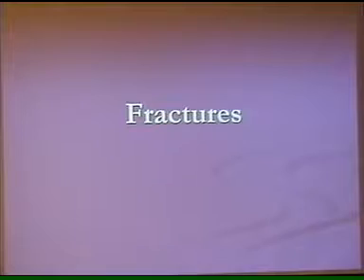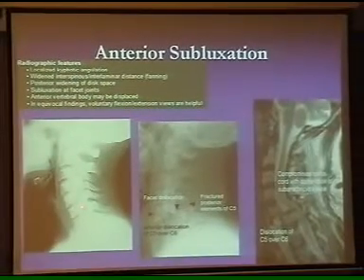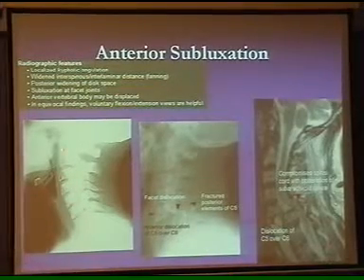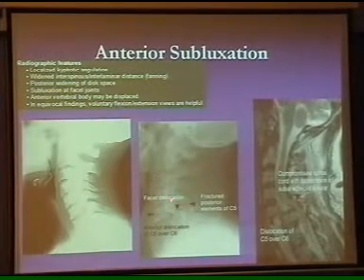Now I'll just show you the different areas. Fractures I'll just run through, because my colleague has very nicely elaborated. I'll show you a couple of the fractures over here. First of all, I'll show you how subluxations look. There's a normal X-ray, as I discussed a couple of minutes back. You can see the prevertebral space, you can see the anterior and posterior spinal lines, and that's pathology.